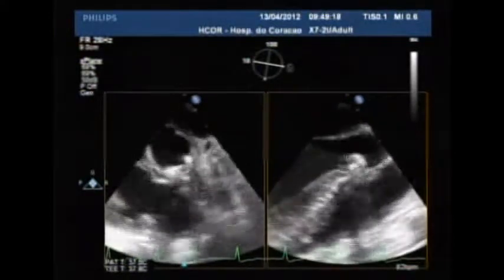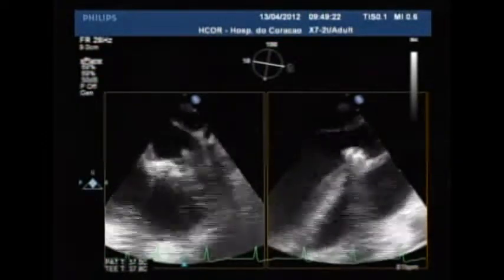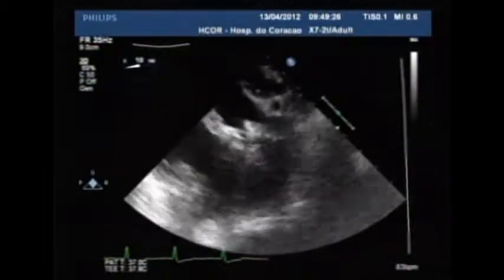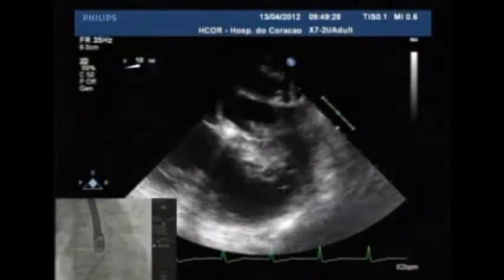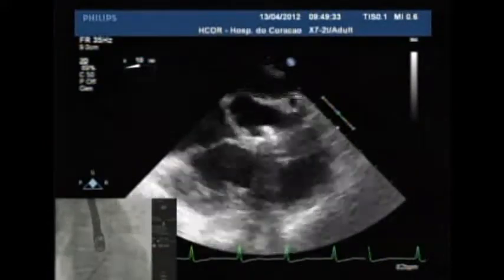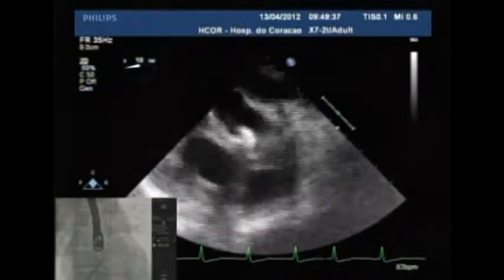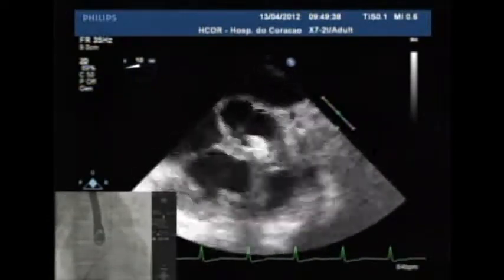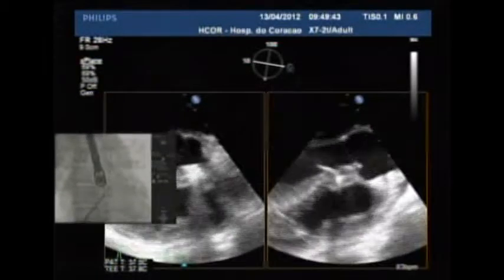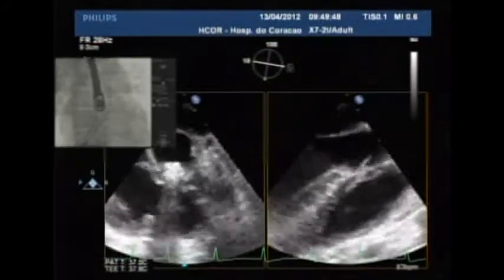Yeah. We are close there. So he's going to bring everything back as a unit until that disc engages inside the VSD. In fact, on the left side of the VSD, it's a very floppy device. You have to be careful not to exert a lot of tension so that you would pull through. I think he's in the right spot right now, and probably he's ready to deploy the right disc.